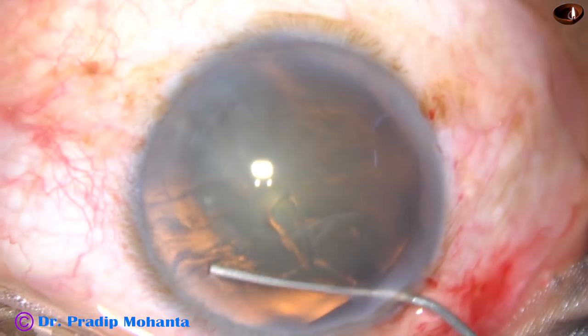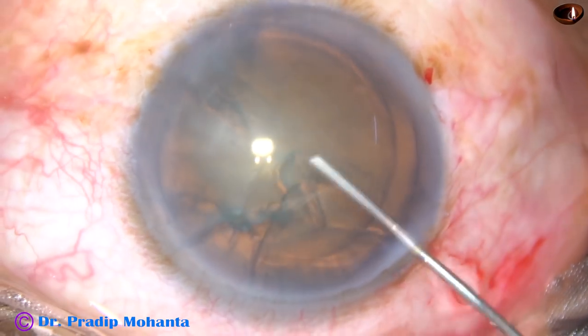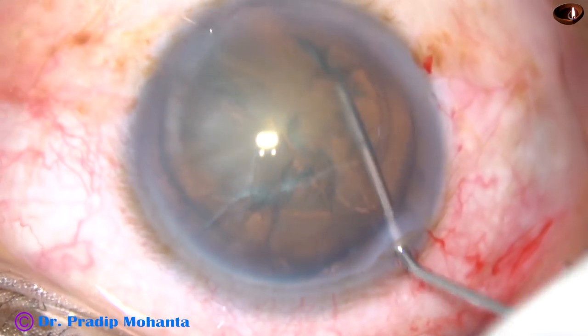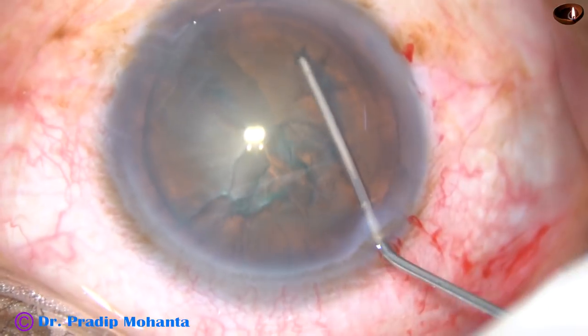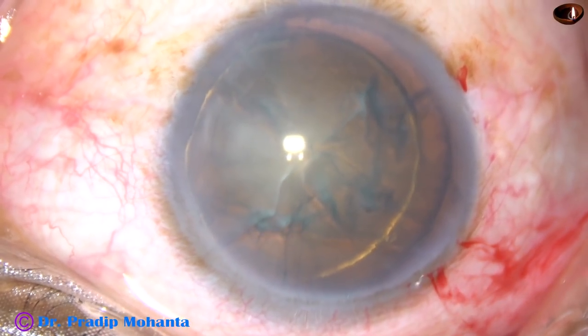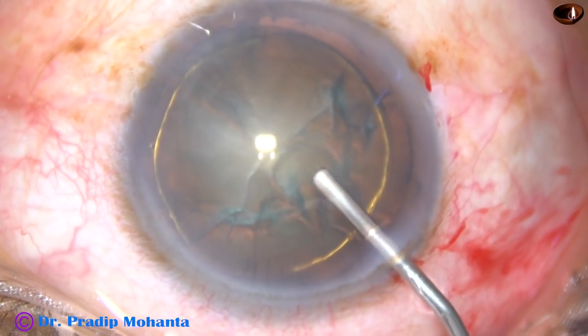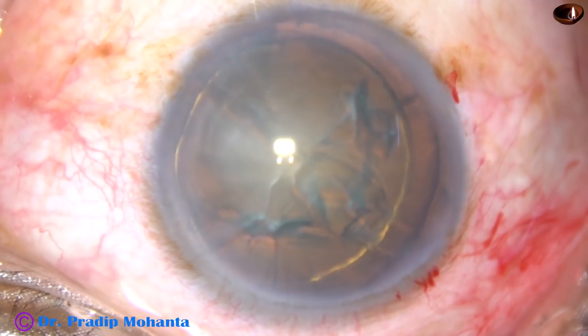Now see the hydrodissection. The fluid wave goes to the opposite equator. And hydrodelineation is attempted, and there is a golden ring which demarcates the nucleus and epinucleus.